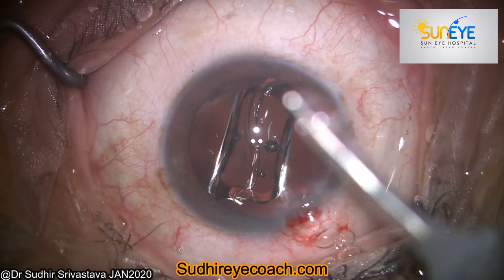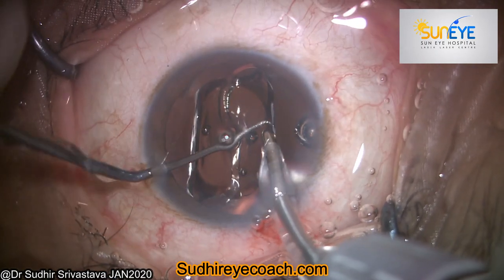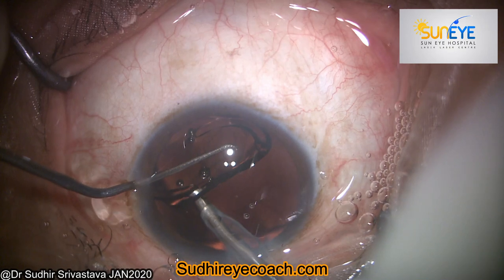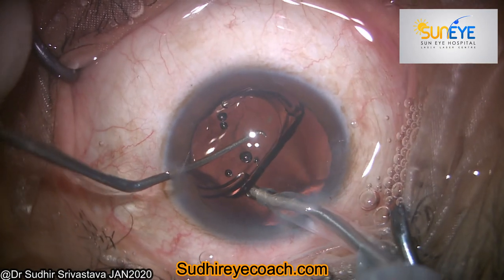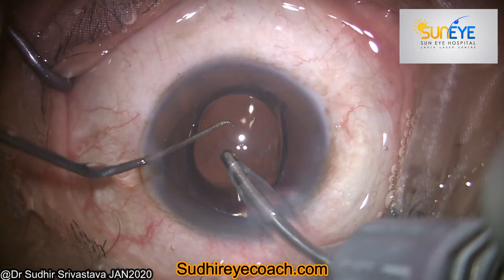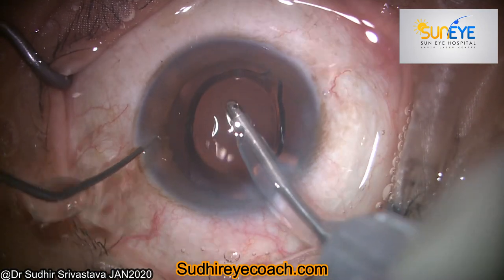If you perform OVD removal through the two-compartment technique, where we go behind the IOL and wash the OVD from behind the IOL and from the bag, and then place the irrigation and aspiration tip over the IOL to wash the OVD present in the anterior chamber, from the angles, and over the IOL.